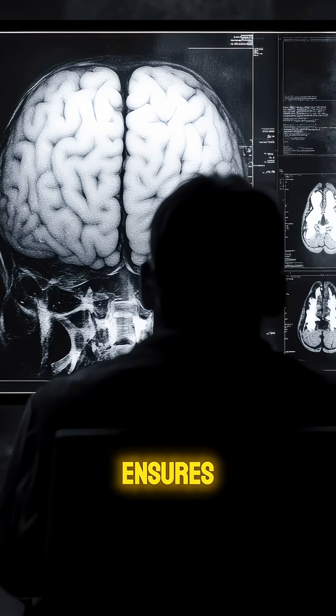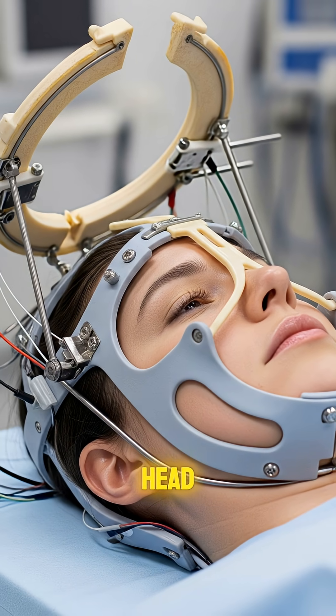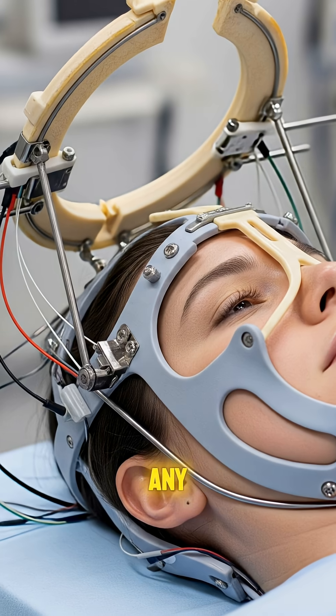Prior to the intervention, a detailed 3D scan of the brain ensures precision while a special frame or mask is placed on the patient's head to hold it in place and prevent any movement.